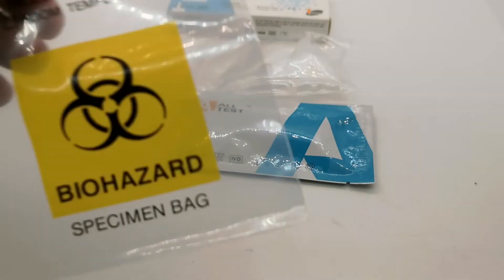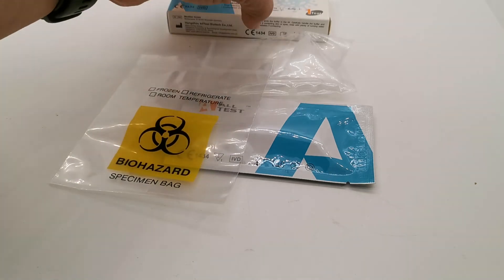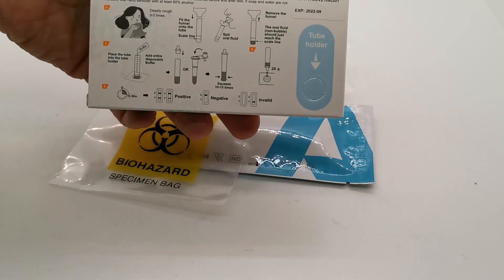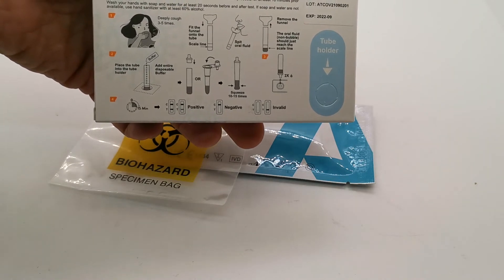You also get, for disposal, a small biohazard specimen container vial. Also included is a full set of instructions and data sheets in addition to the manufacturer's quick instructions on the reverse of the box.